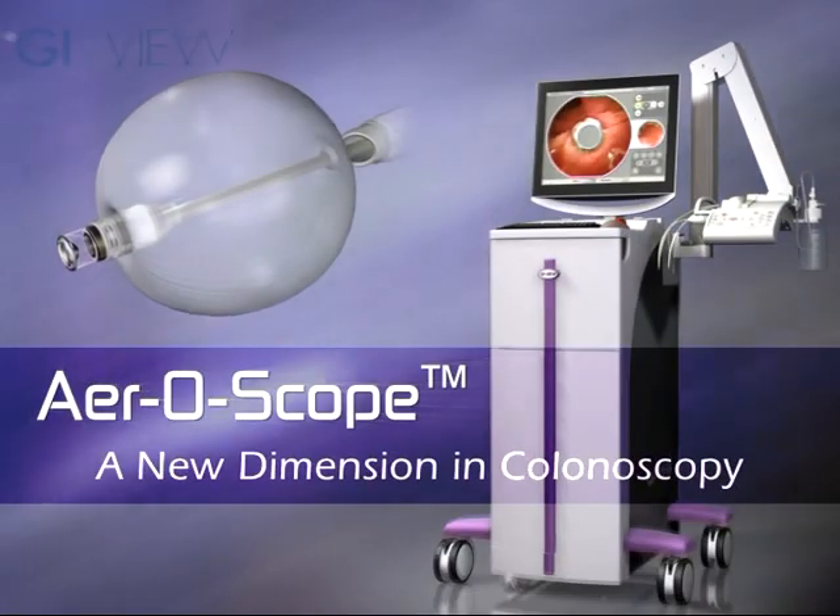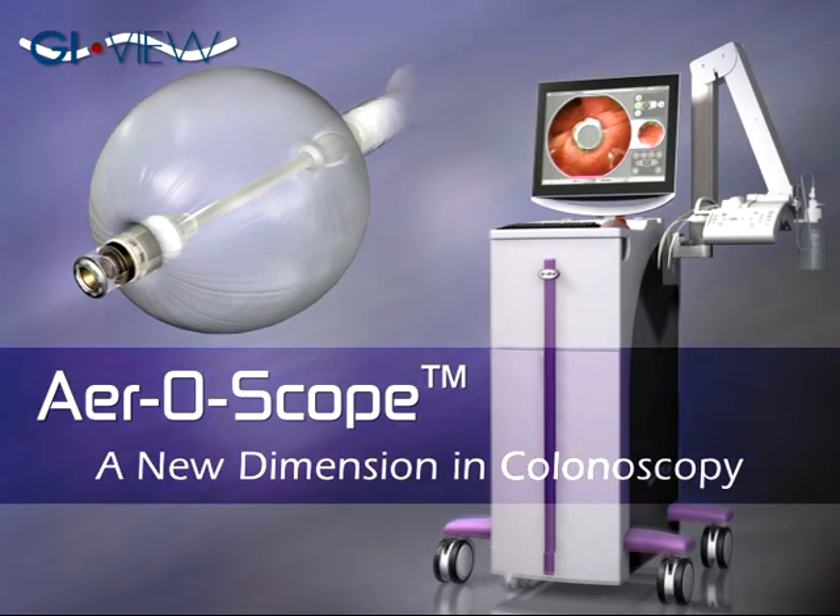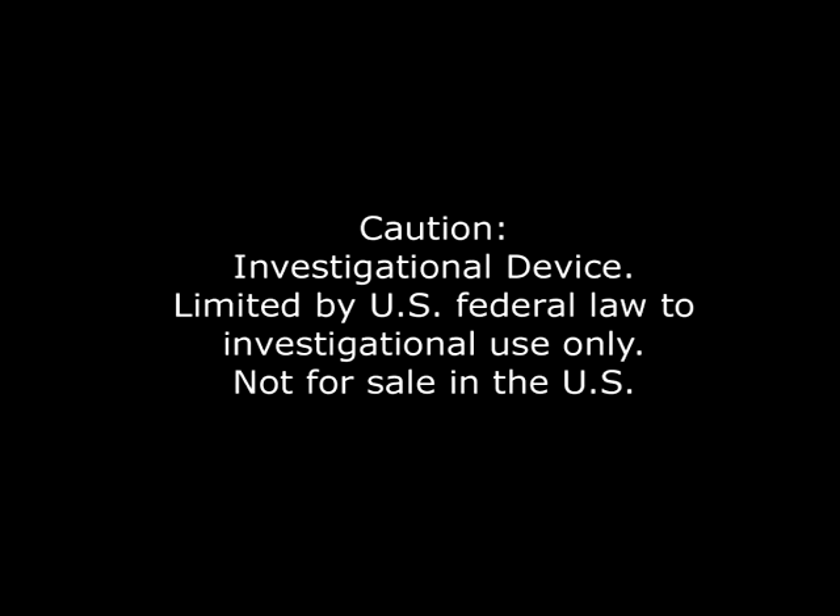Aeroscope, a new dimension in colonoscopy, from GI View. At present, Aeroscope is available for investigational purposes only.